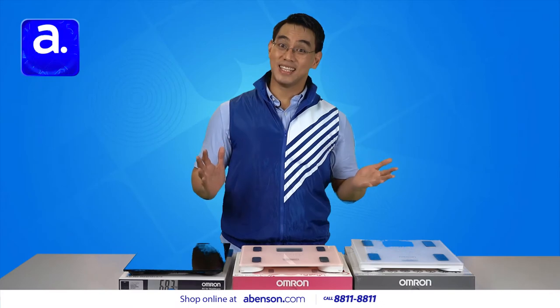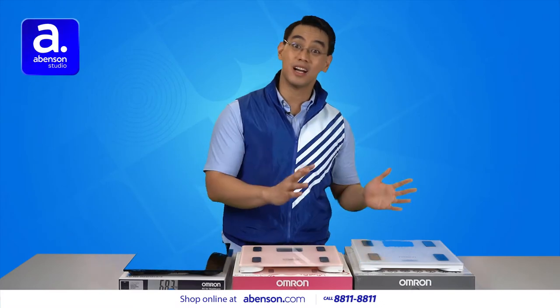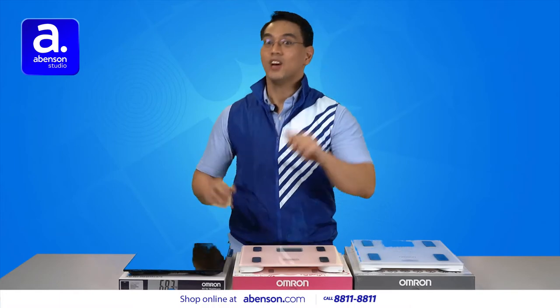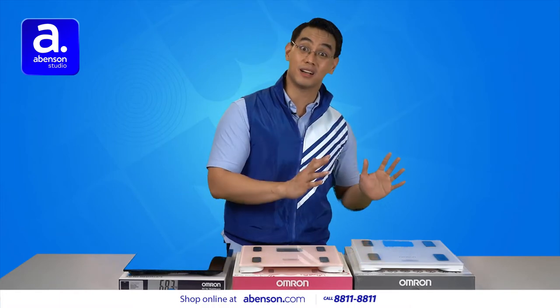Hi everyone, I'm Noel, your resident Abinson guy, and I am back with even more healthcare and wellness products from Omron. Today, we are spotlighting their digital weighing scales and body composition monitors.